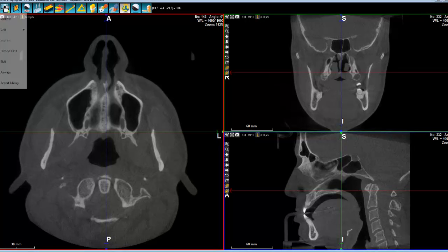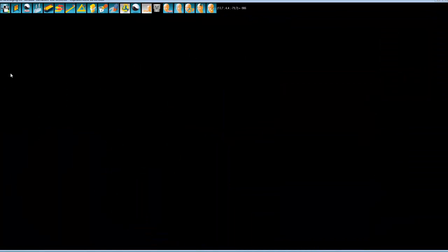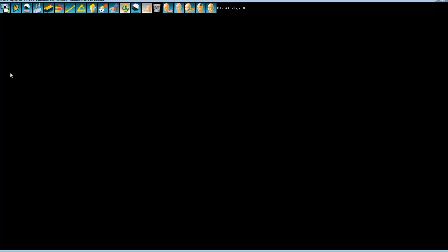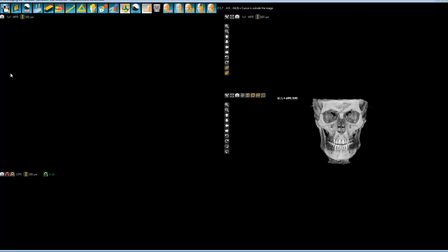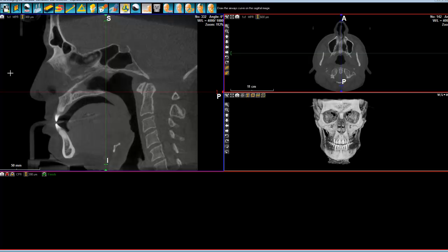In order to do that, you need to select your diagnosis, and of course it's going to be Airways. Then here the software is asking us for a similar cut as we were doing for the panoramic.